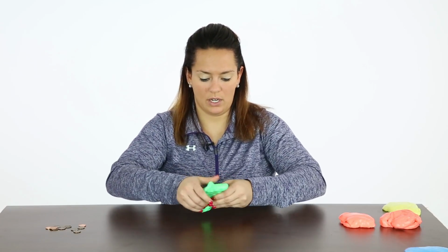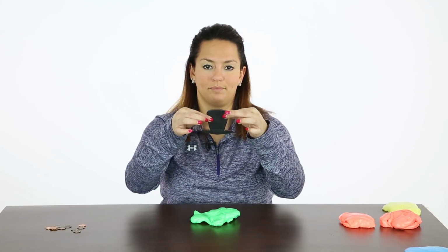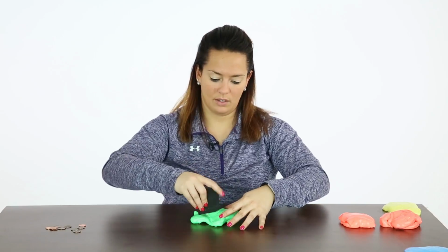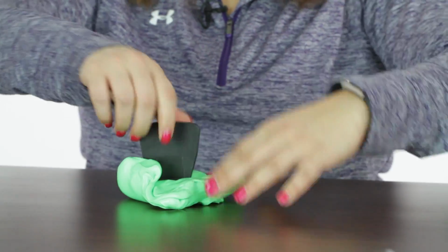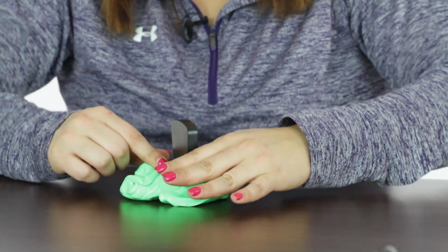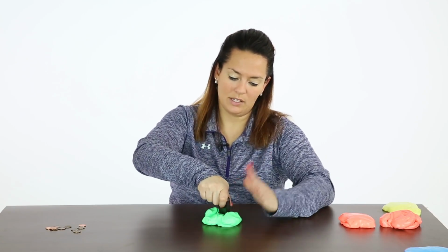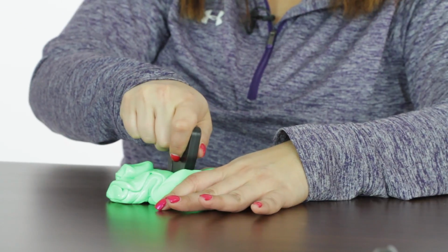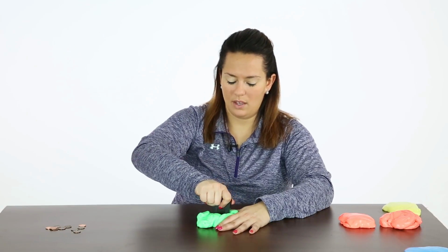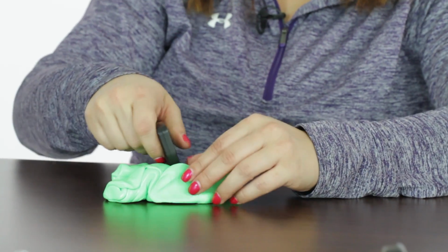And a putty size tool that we're going to use with the medium putty is the key turn. So again, we're going to hide this T part of the tool. So I'm going to push it in there, hide it. For a key turn, you're going to use these 3 pincer fingers. We're going to stabilize the putty, and we're going to turn both to the left and to the right. So again, the putty is providing resistance as I'm using these fingers that I would need for a key to simulate a key turn back and forth in the putty.